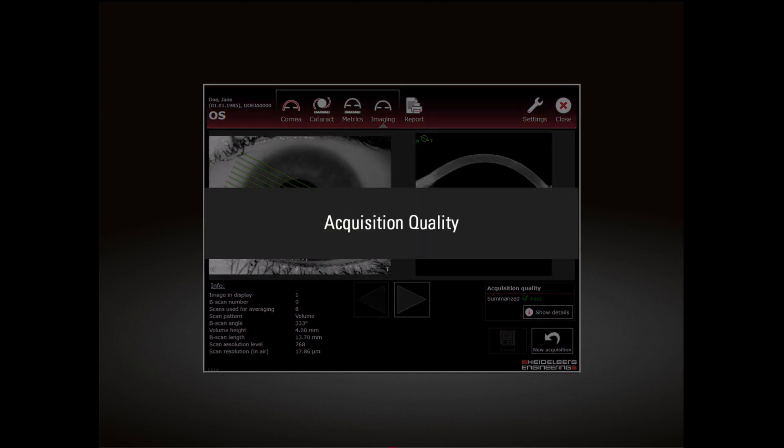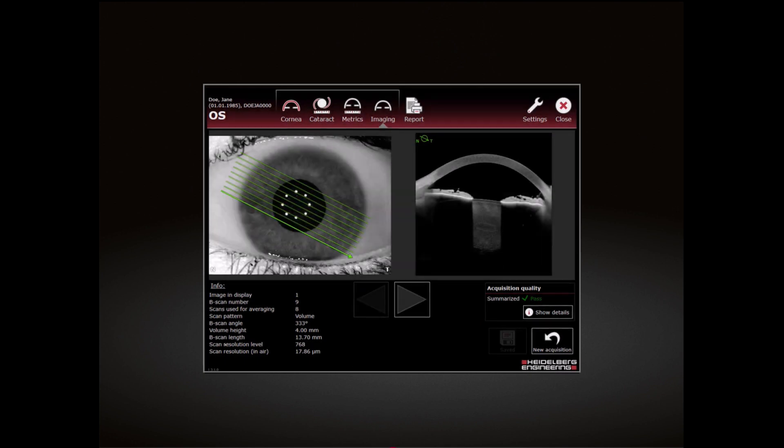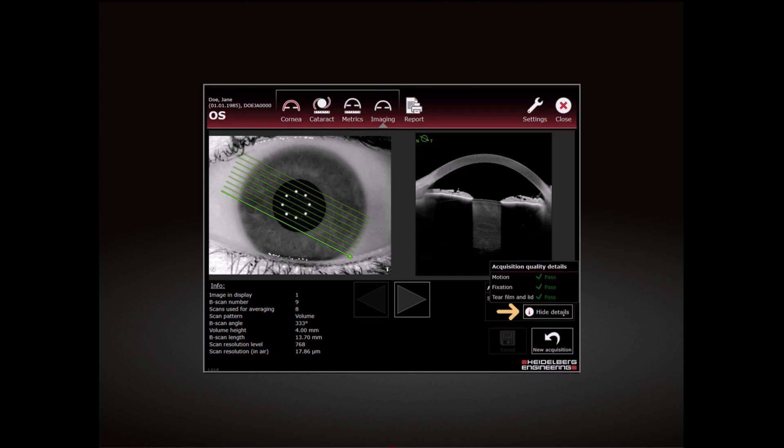Acquisition Quality: After the examination process is completed, the acquisition quality is checked. To display the detailed acquisition quality results, tap Show Details.